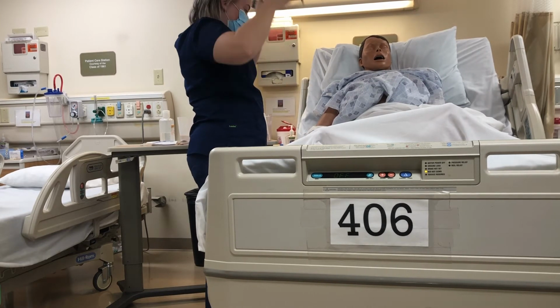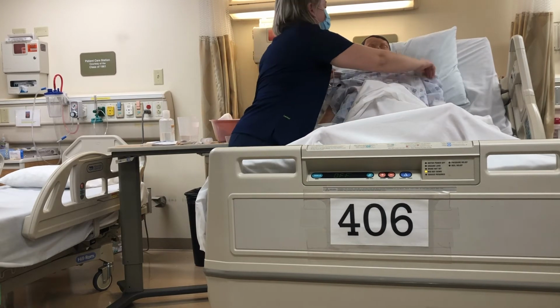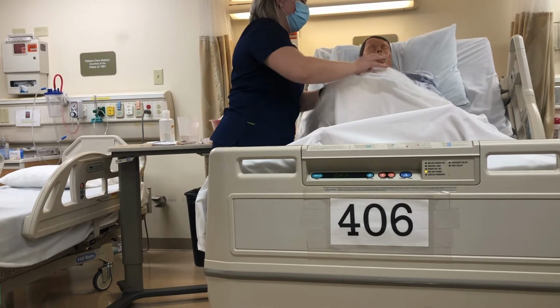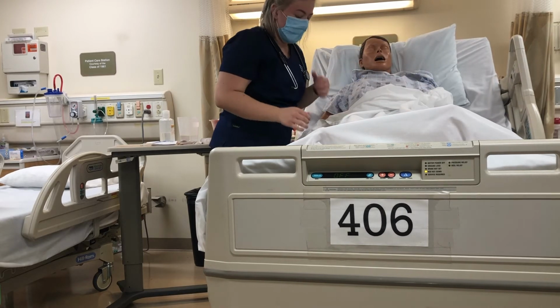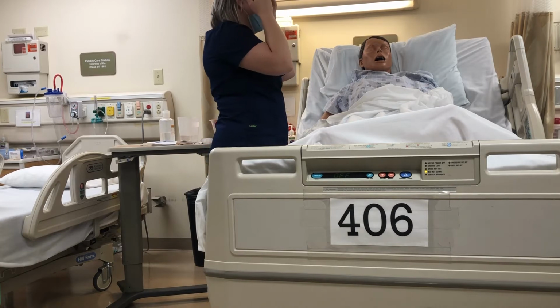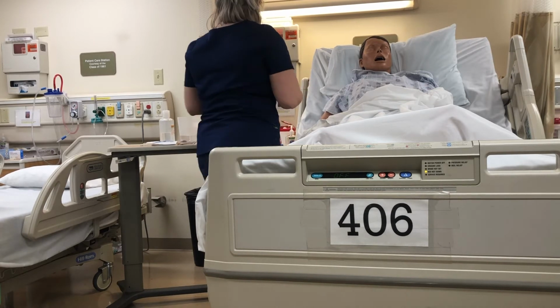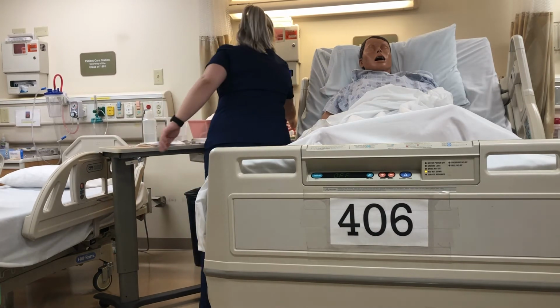Alrighty, so your lungs sound good, but I wasn't hearing as much activity in your abdomen as we'd like to, so I think placing that NG tube is going to help alleviate some of that pain and hopefully get your bowel rested and then get it moving again. So we are going to go ahead and get ready for the procedure.